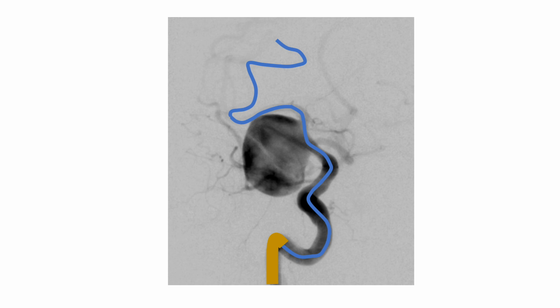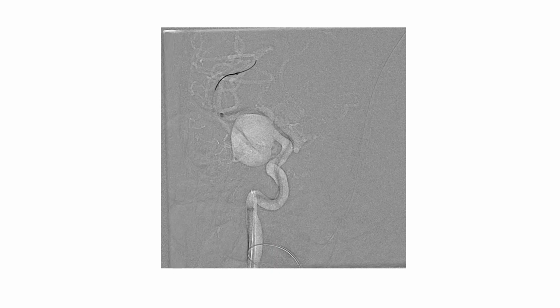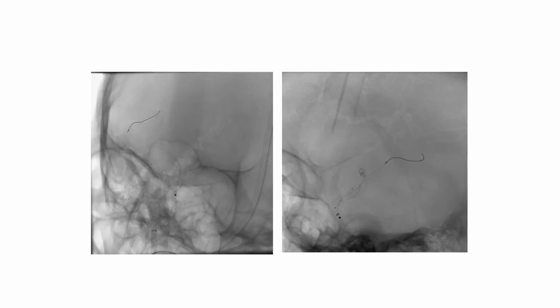So it's good to have it very distal, because by the time you see the tip moving, you know it's straight. Also remember, sometimes the whole thing will fall back, and that's why I said to fill it up with contrast so you can actually see. Then it's straightforward. You can just cross, like in this case, put a flow diverter across it and do the treatment. So this was successfully treated. This is a very, very easy way to cross a difficult aneurysm where you may have to struggle for hours, but if you know the technique, it doesn't take more than a few minutes.